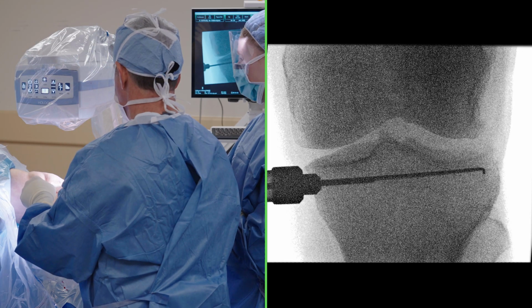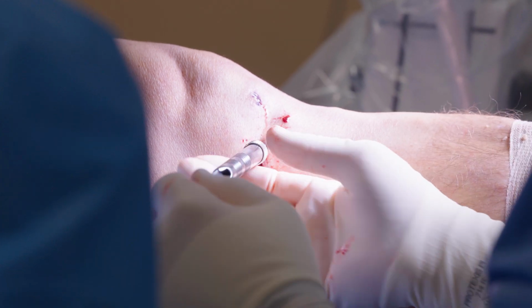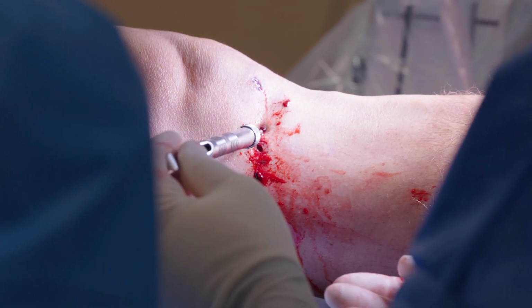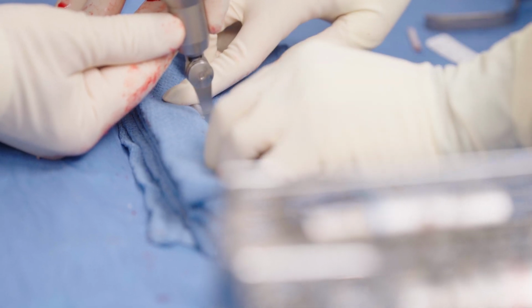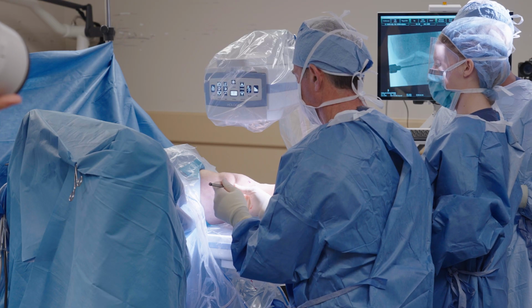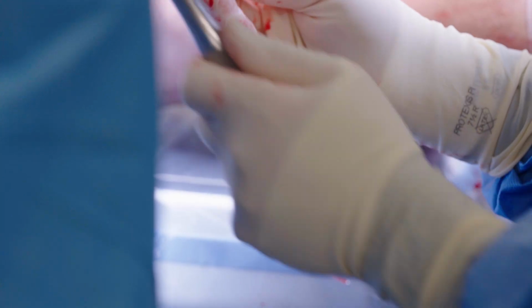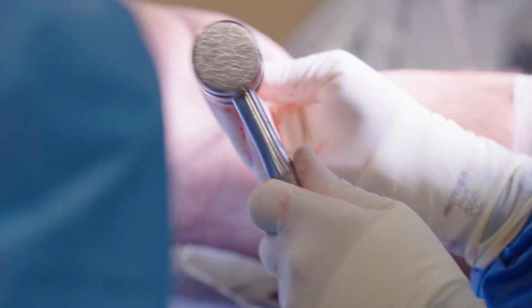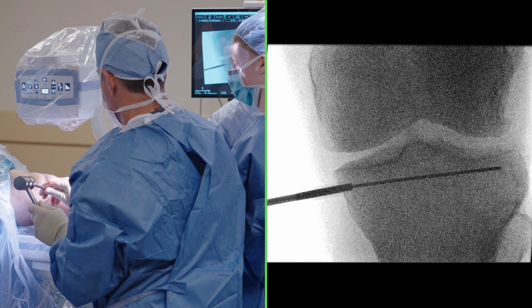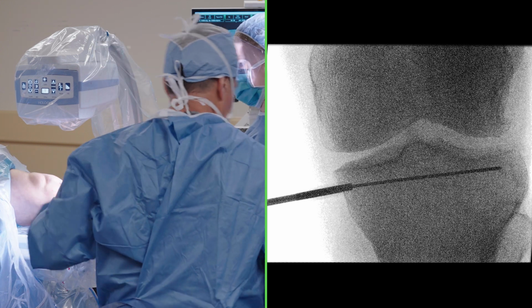So we're going to go with a 66. I just don't want it to be long on the contralateral cortex. So we'll cut our pin down to length. Just flushing it up to the near cortex, and the pin gets removed.